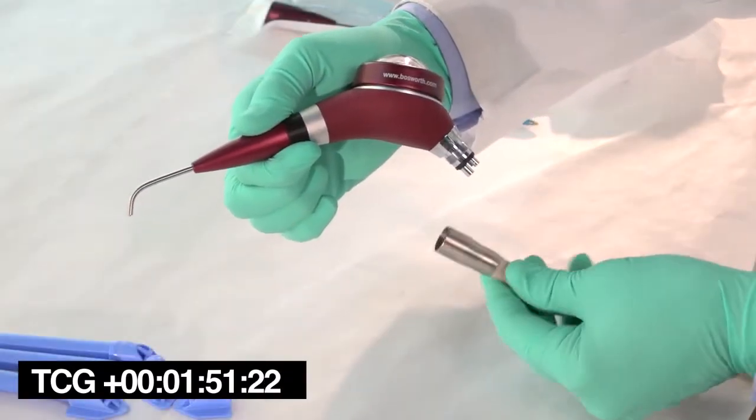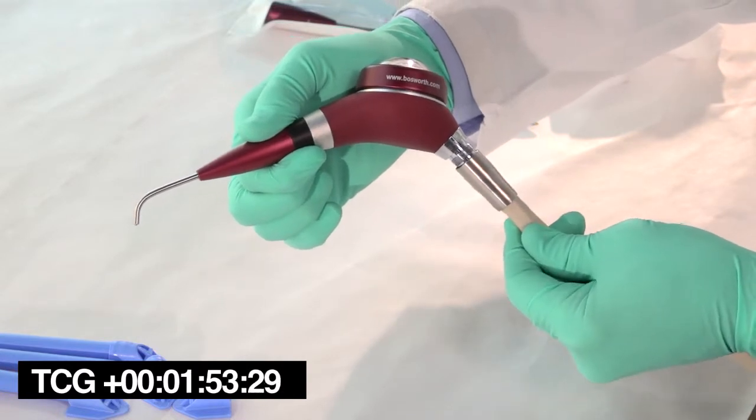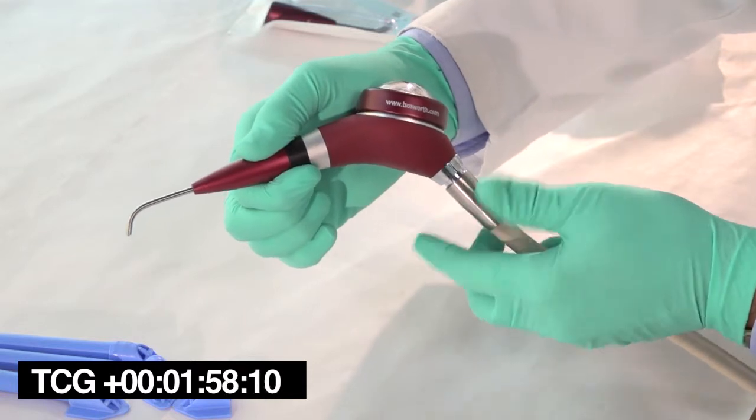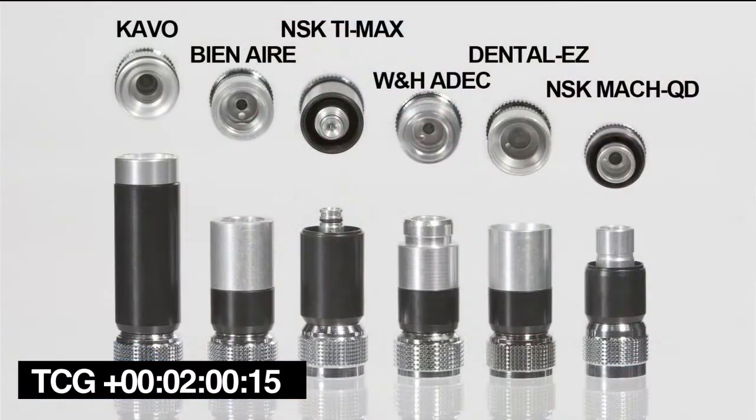The air polisher easily connects to most 4-hole handpiece connections. If needed, adapters are available for the following systems: KaVo, Bien Air, NSK MACH-QD, NSK Ti-Max, W&H ADEC, and Dental-EZ.